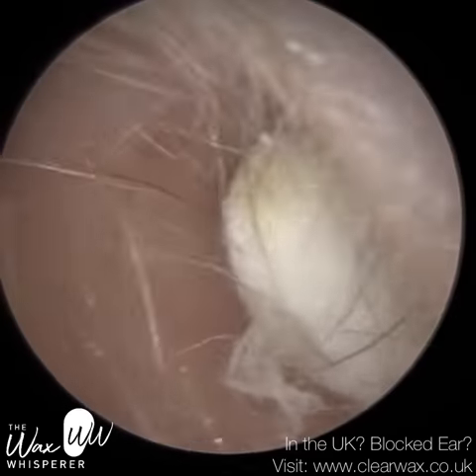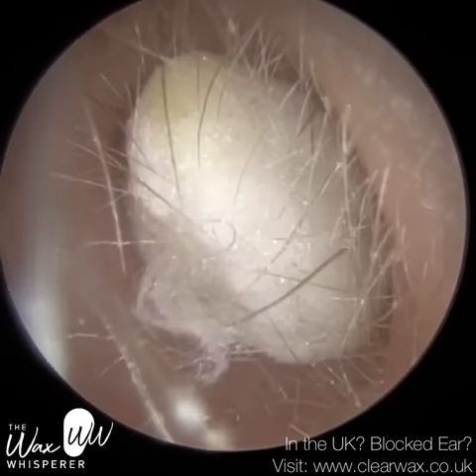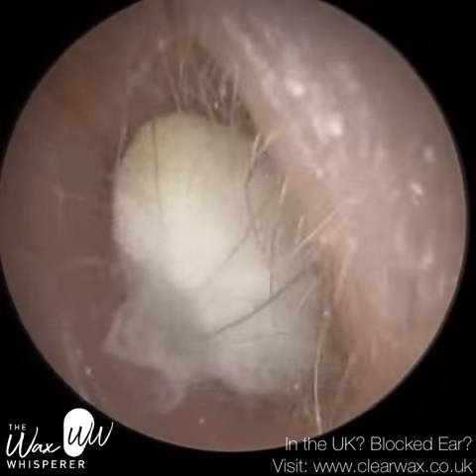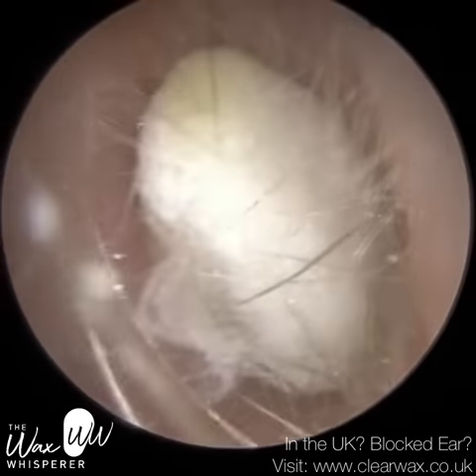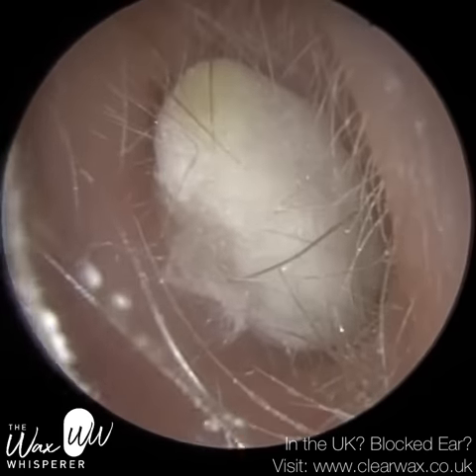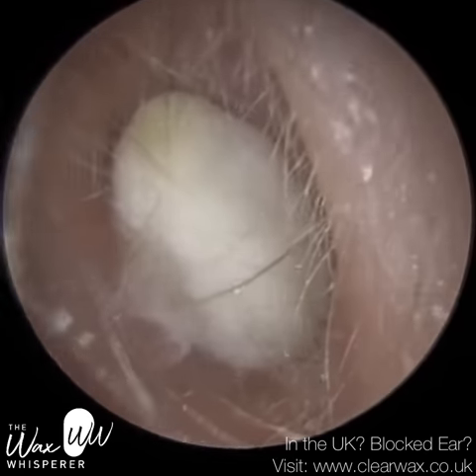Hi everyone, this is Mr. Neil Ryderter, also known as The Wax Whisperer. Thank you for joining me in my latest video. We have yet another very interesting case. This is of a patient who attended with an ear infection in their left ear.